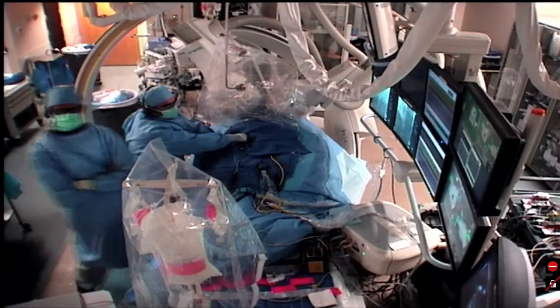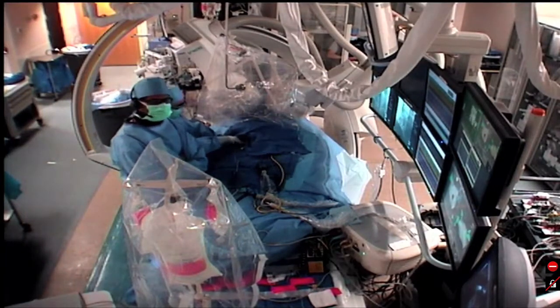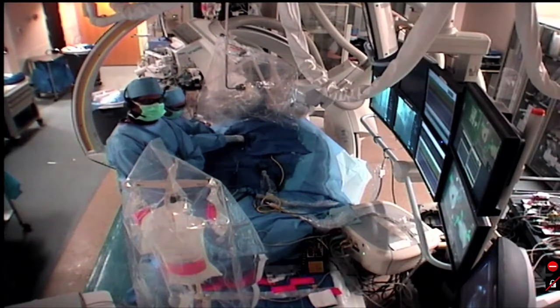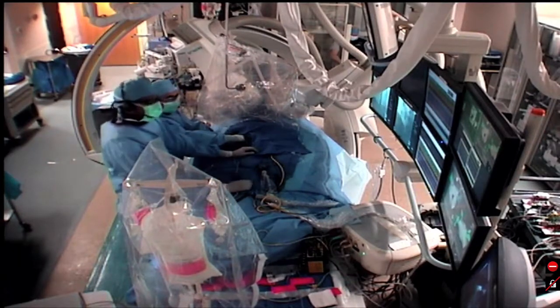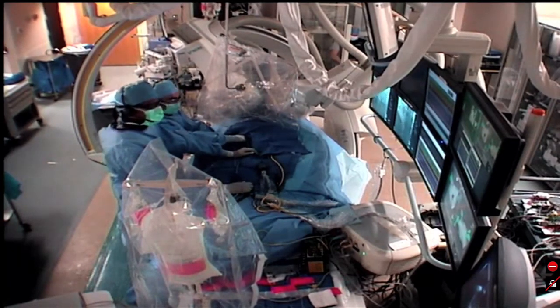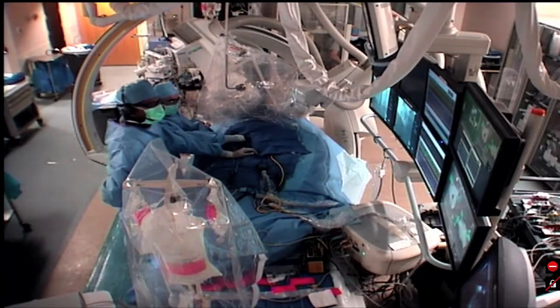Any questions from the audience? Yes, we have a question there. Can you hold on one second? Can you activate his mic, please? Hello? Yes. Shouldn't the tachycardia terminate while he's ablating there? If he's finding a rotor and ablating in that area, shouldn't the AFib terminate? Oh, so the question is, should AFib terminate? So, Dave, do you expect AFib to terminate when you ablate the rotational areas?